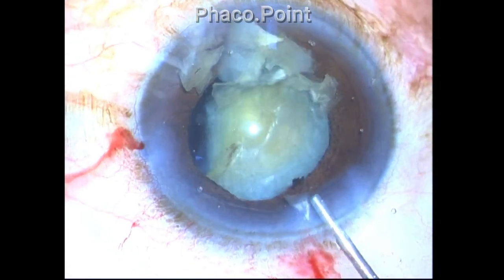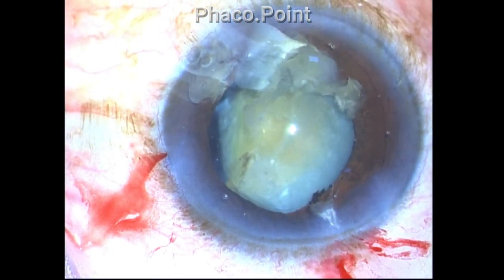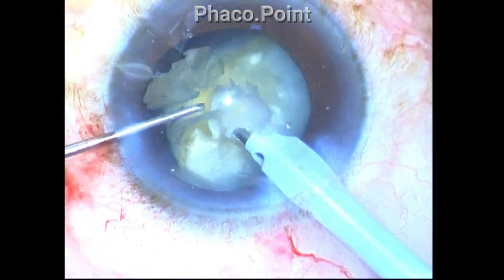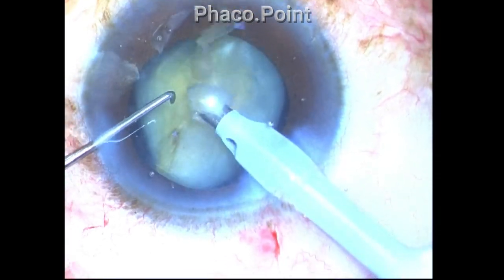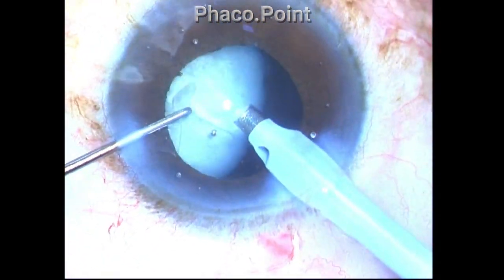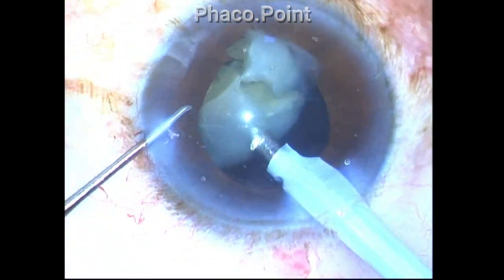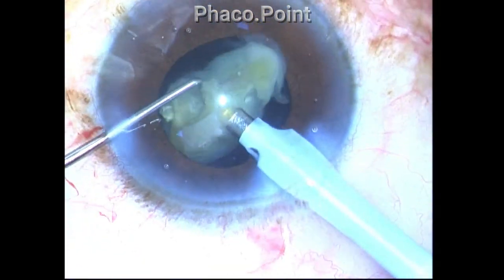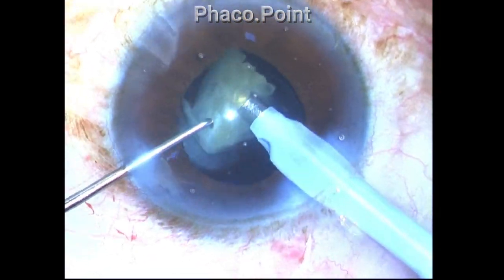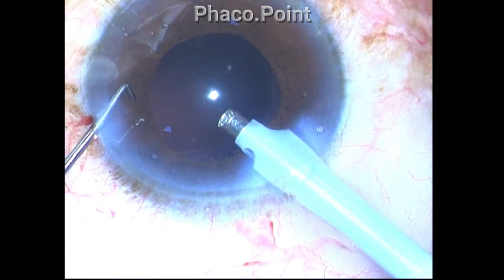And as a last ditch maneuver, I decided to change the phaco tip, because that's the only thing I had not changed, as well as the sleeve. So I got back the tip that was originally given to me, which was, although a little frayed, I thought, let me try. If this effort also fails and if the chamber collapses at this point, I would have to convert it into an SICS and then find out later on why the chamber stability was not good. But with the change of the phaco tip, there was a dramatic improvement in the situation. The anterior chamber stability was normal and it was quite easy for me to effortlessly remove the remaining pieces of the fragment. You can see how rock solid the anterior chamber is.